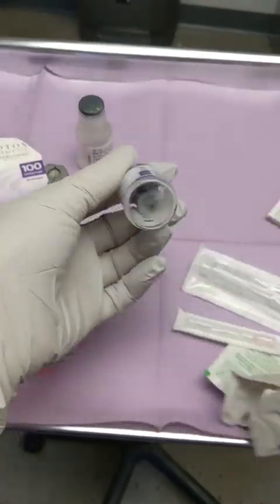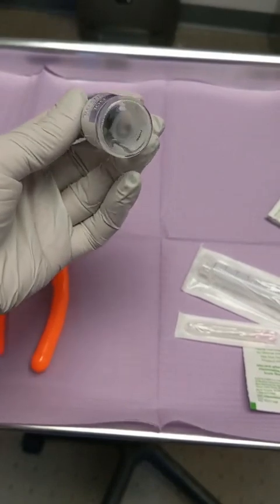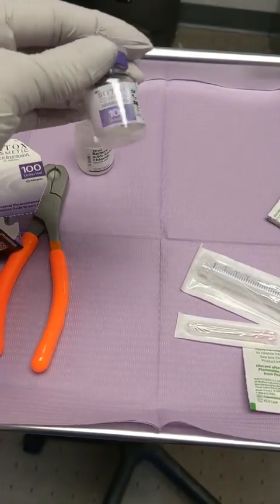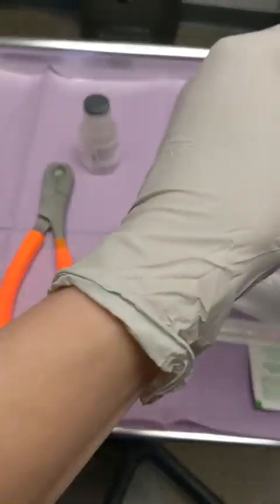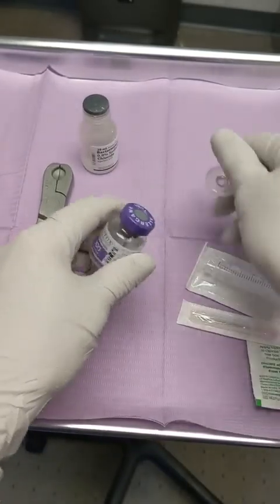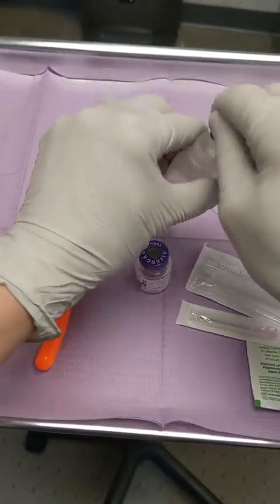I'm gonna show you that right here. You see there is no liquid — there is just kind of white dust on the glass. So to make it usable so that we can inject it, I have to add bacteriostatic solution. That's what I'm gonna do.